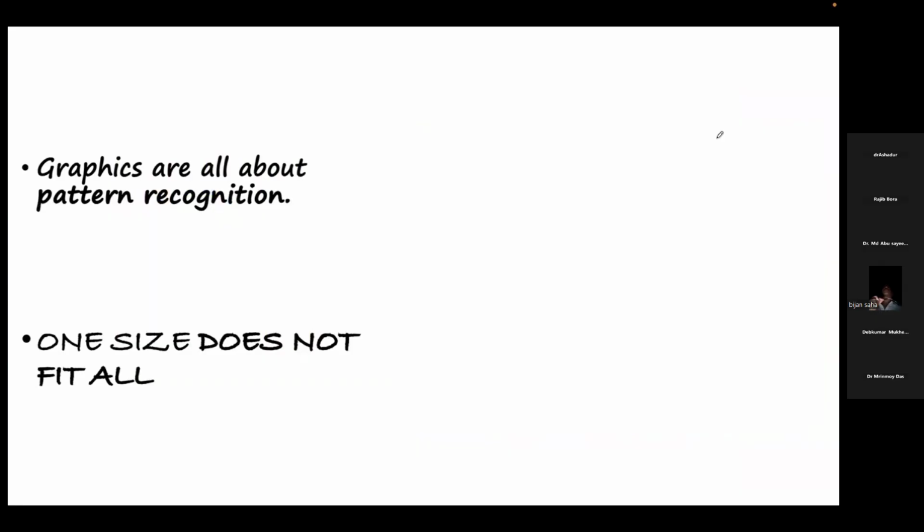But the most important thing, as he has rightly pointed out, is that if you do not see these graphics daily, if you do not know your ventilator and your device, you will not be able to understand what is happening to the baby. Even if there are some changes in the graphics, we will not be able to pick them up. That is why every day you have to go to the baby and see what is happening. And these graphics have to be interpreted in the context of the baby's clinical picture and the pathophysiology of the lung, which can be understood from the history, etc.